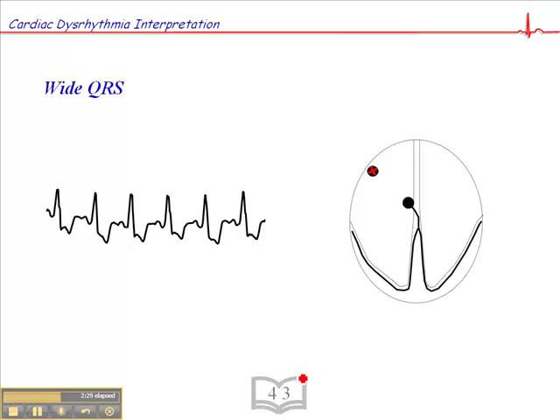If a QRS is wide, we have to determine whether the rhythm is sinus in origin or whether there's some other ectopic focus at play. In this rhythm, for example, we have P waves preceding wide QRS complexes consistently. Assuming the P wave morphology is consistent throughout, the rhythm is regular, and we can see a P wave preceding each QRS, then we know this is a sinus rhythm.